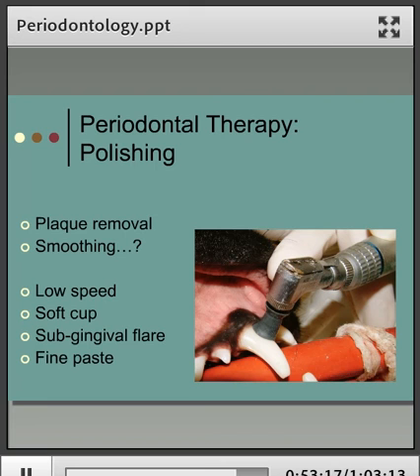And again, what we don't want to do is heat our tooth up, so when we're polishing we do brief contact time with the tooth as well, and usually overlapping strokes, starting at the gingival margin and getting that flare, and then down to the crown, and then overlapping stroke again next door to that, and so it goes on. But if no brushing is going to happen, don't bother.